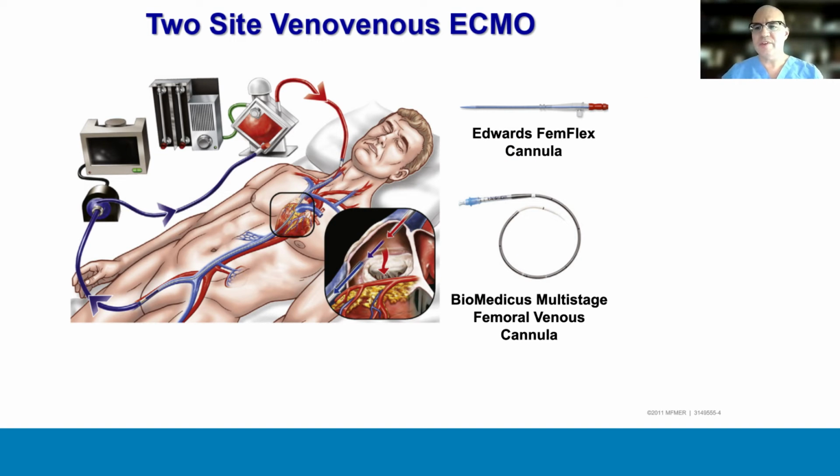So really, I'm going to go over several different considerations for cannulation sites. So let's just say your patient came off, had lung injury from a long bypass run, and you want venovenous ECMO. Well, this is readily achieved through percutaneous configurations, and you're able to close the chest. So shown here, you have two-site venovenous ECMO, where you have a femoral venous cannula, goes into the ECMO support through the oxygenator, comes back in through the right internal jugular vein.